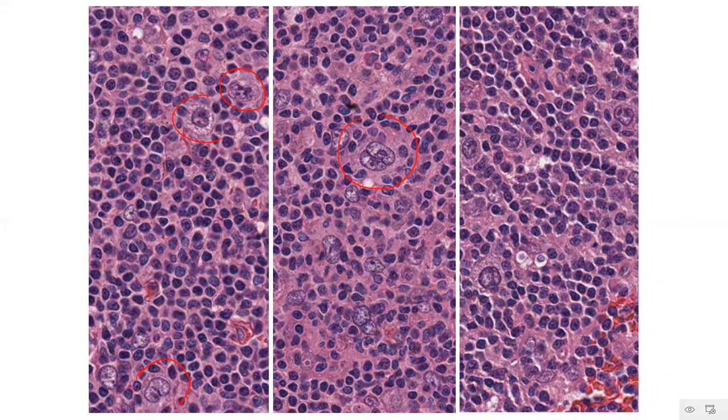Now, this particular cell does look a little bit like a Hodgkin Reed Sternberg cell. So you have atypical cells of varying sizes, but quite a few which still makes you entertain the possibility of a nodular lymphocyte predominant Hodgkin lymphoma. And that's the most important issue in the case of the lymphocyte rich category of Hodgkin lymphoma. You can never get the suspicion of NLPHL out of your head. That will basically haunt you till you have reached the end of your IHC profile.